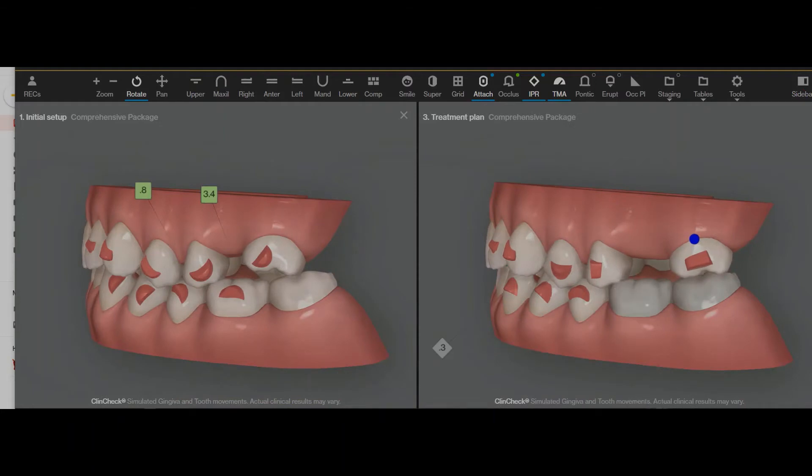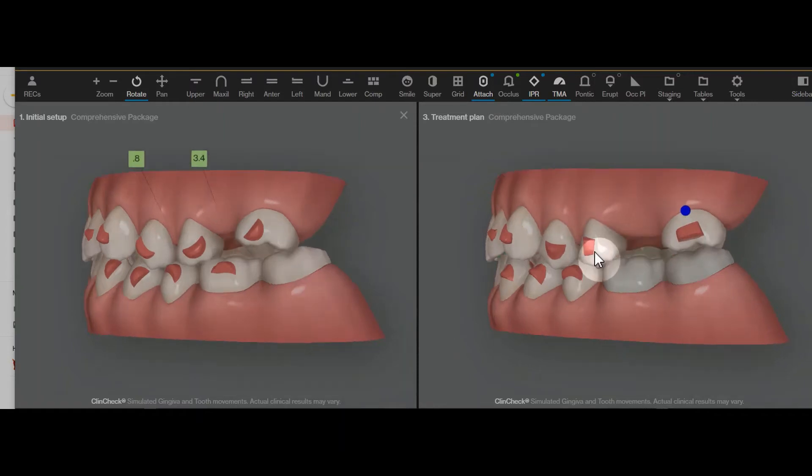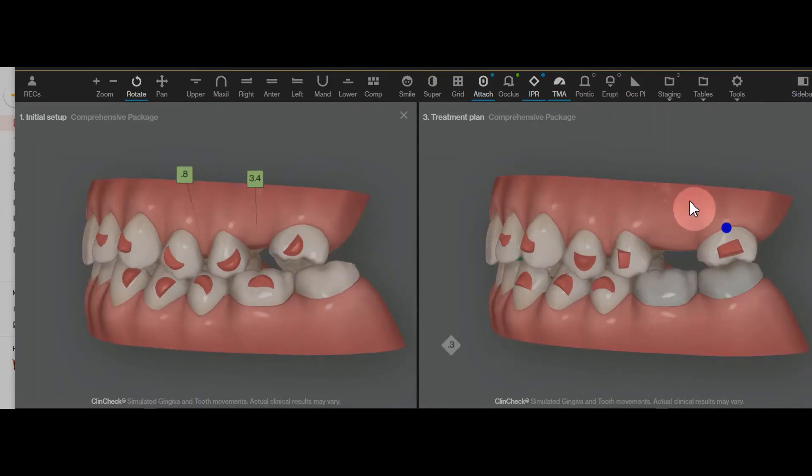After you get to maybe aligner 15, 16, or 17 and you're more content with this space, then the implant can go in. While the implant is healing, the rest of these movements can be executed. The implant going in here is only going to help stimulate the movements of these premolars.